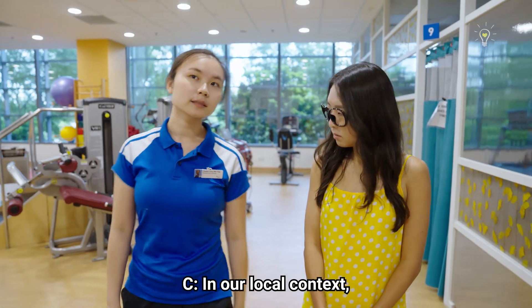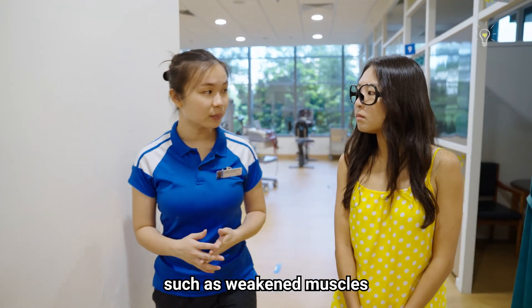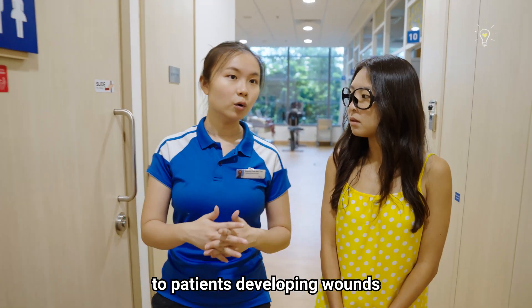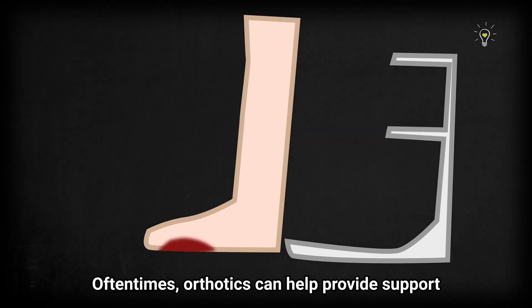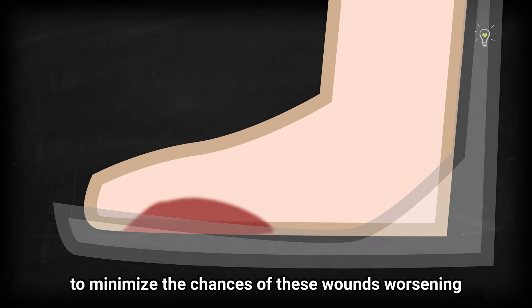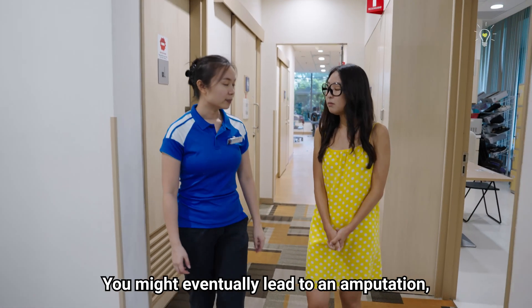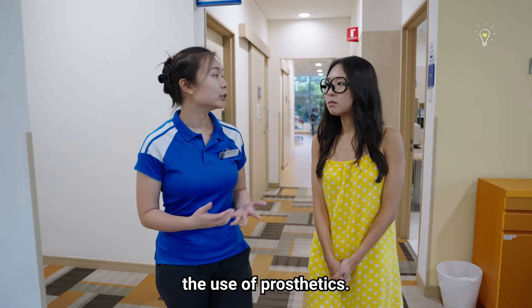In our local context, conditions such as diabetes could lead to weakened muscles or loss of sensation, causing wounds that won't heal well. Orthotics can help provide support and protection to minimize the chances of these wounds worsening or even occurring. If wounds are not managed well, it might eventually lead to amputation, which might then require the use of prosthetics.